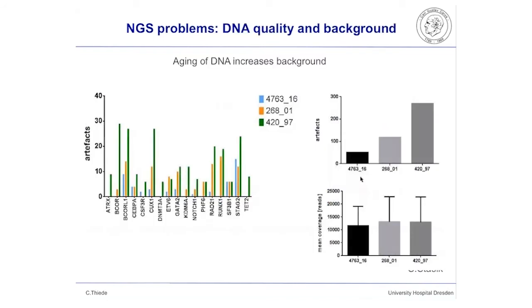We do have also some evidence that there is an issue with the DNA quality. We were not aware of that before.